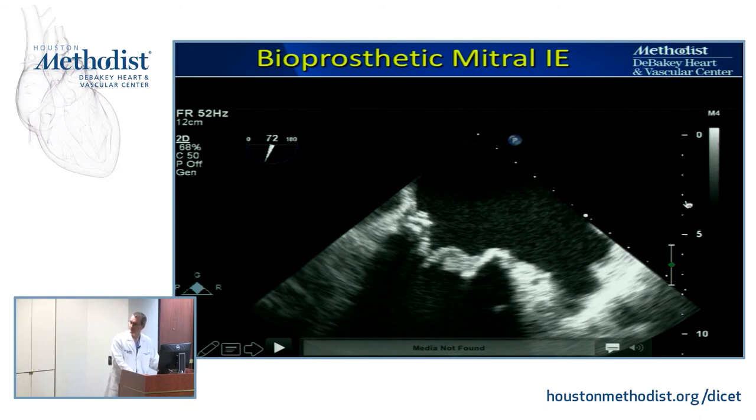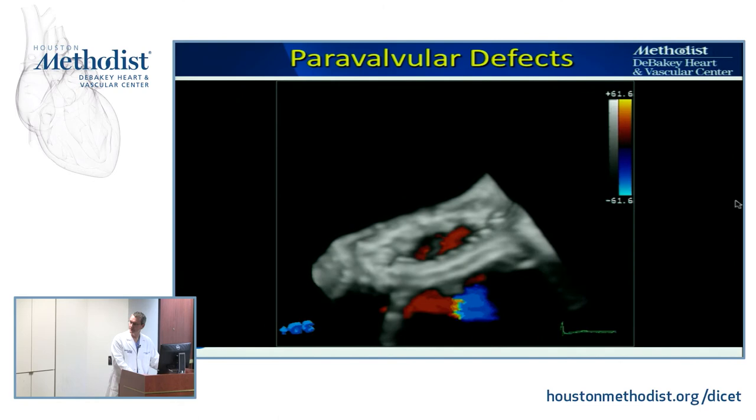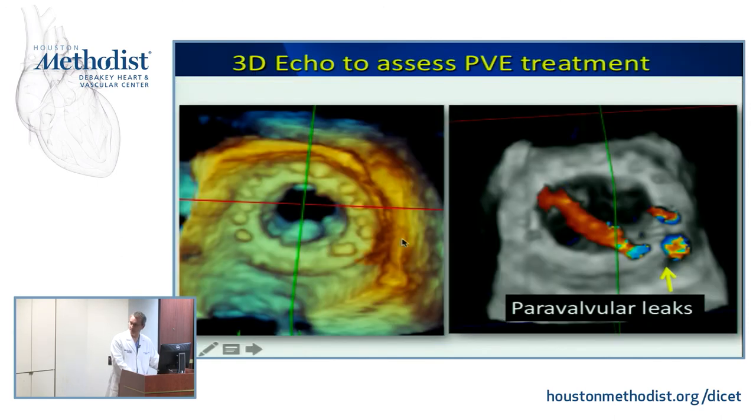Staff, I've shown this video before. Six weeks of IV antibiotics, and a guy who the surgeons did not want to take to surgery. He didn't want to go to surgery. So this is one of the very rare instances, and I don't know why this video used to play and won't now. He got away without redo surgery on a bioprosthetic mitral that was infected. The only time I've had that happen.